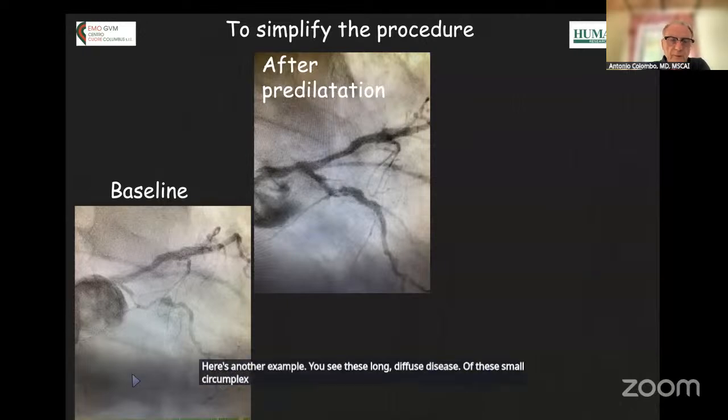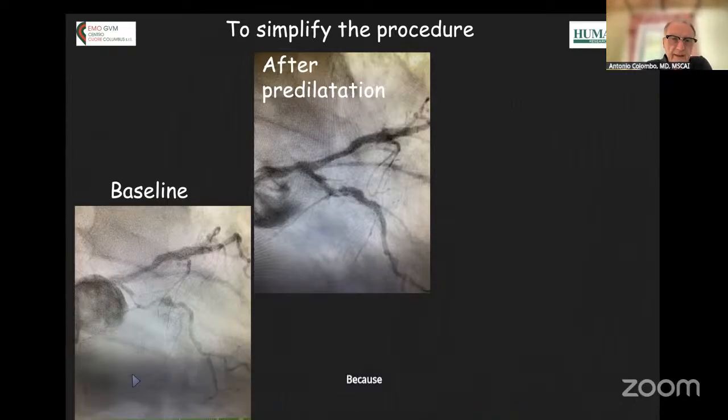Of course, if the patient is asymptomatic, it's better to do nothing, because this could be a headache if you have to implant stents. But if you don't have DCB, stenting the ostial circumflex is not always simple regarding the long-term outcome.